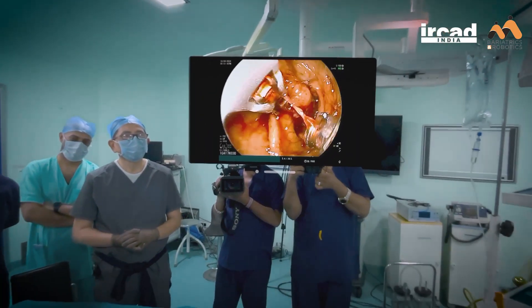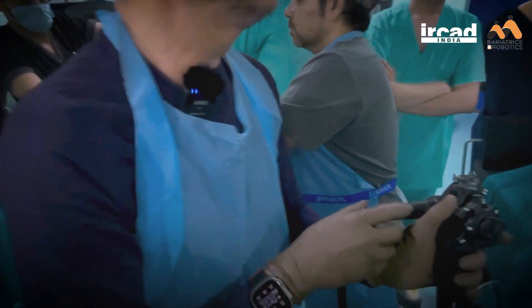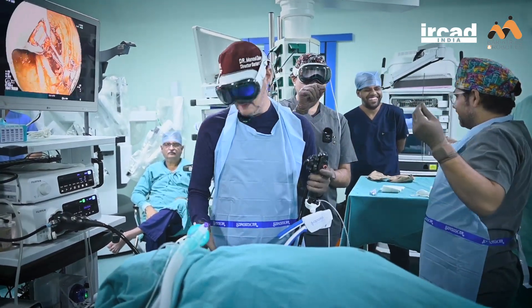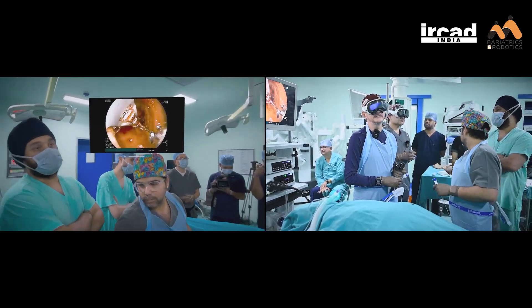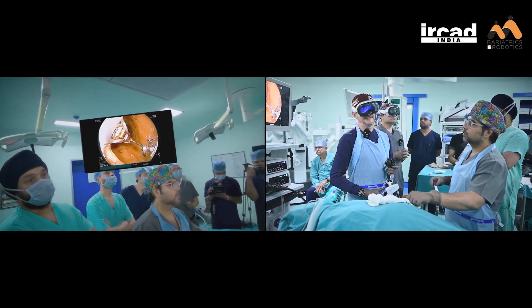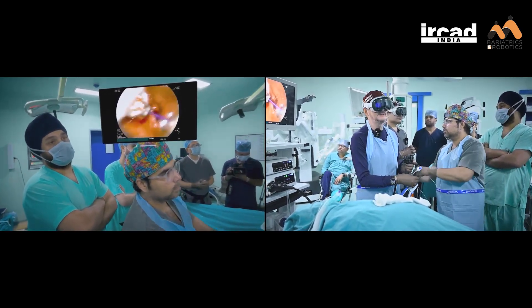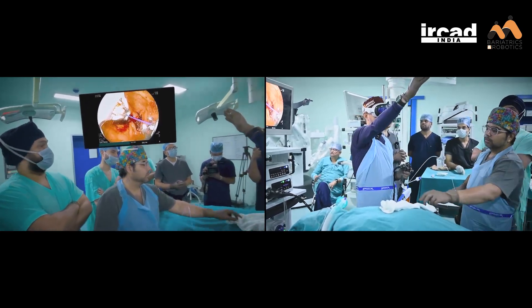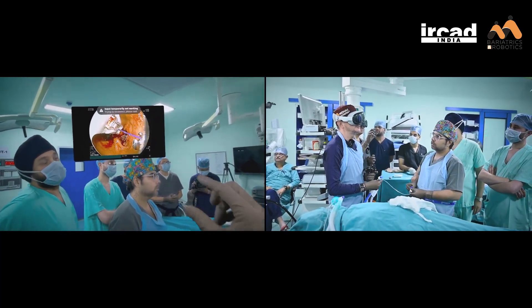This is such a beautiful image. Now to show everybody, let's exchange positions — give them the third person view. Now we're going to load the device, and we have a very selected group of attendees here at our workshop. What I'm going to do now is go anterior wall, greater curvature, posterior wall, and then get back the same way we do for a normal stomach.